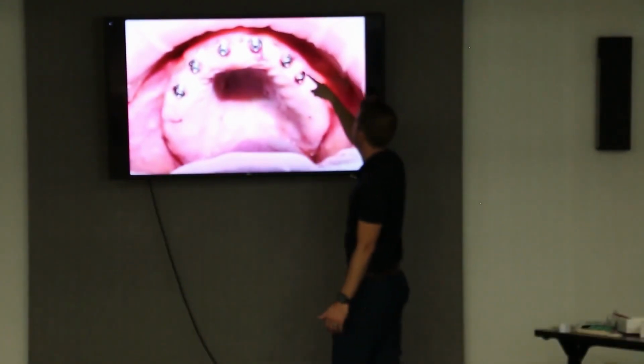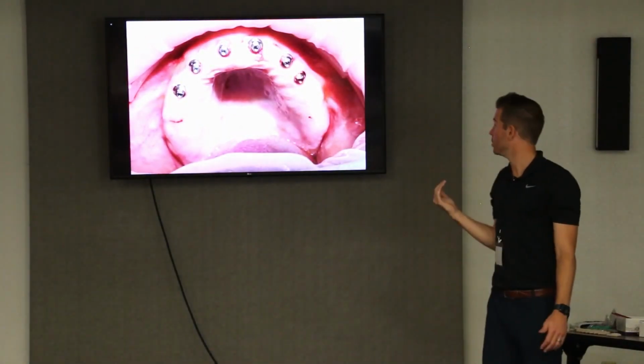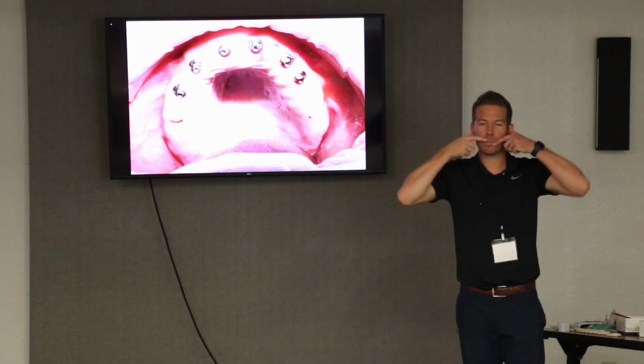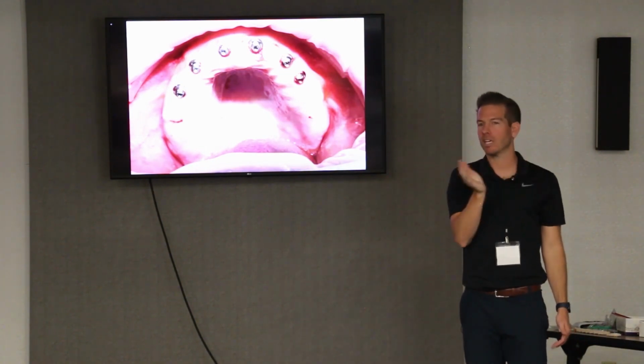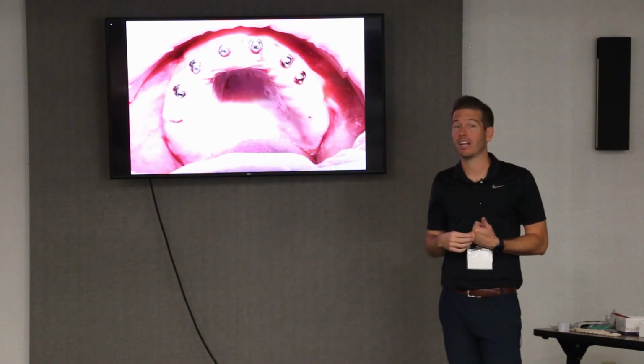mucogingival junction. Here, here, here, here. And so you end up with no keratinized tissue on the facial of those. So not only are they prone to recession, but they're also kind of ugly a lot of times, because you build that restoration, you pull it back, and you can see the metal multi-unit abutment. We see those cases with hybrids, and it's like, fine, whatever, but it's prettier when you don't see that silver.